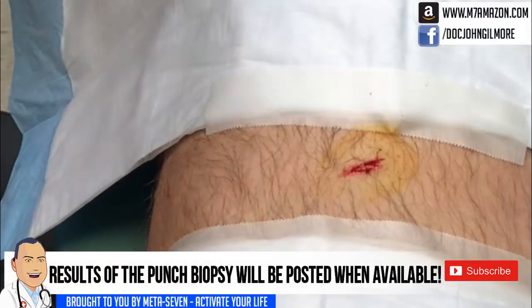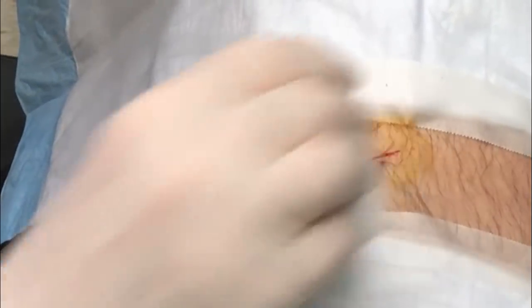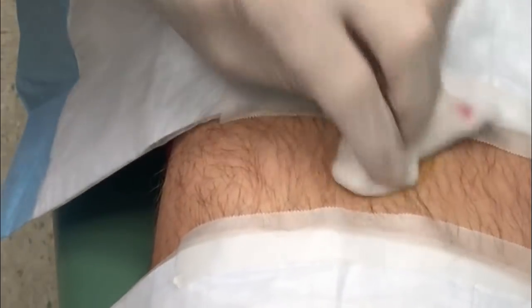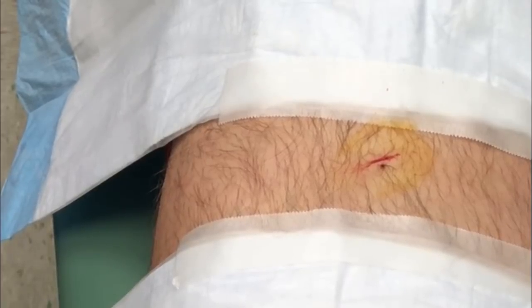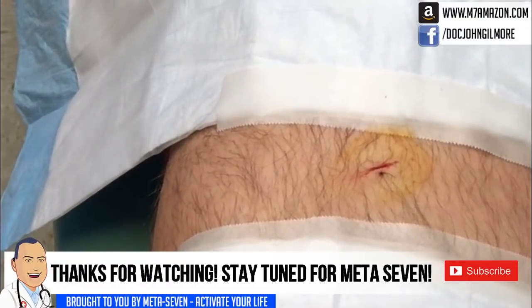There we go — that's one. That should be all he needs. One stitch. Going to put a little dressing on that for you and we'll see you back in a week. Just keep it clean and dry, don't do anything else to it. We'll take the stitch out, and as soon as we get the pathology report back we'll call you. If you don't hear from us before a week, when you come back we'll let you know what we have. Everything went well — you did great.